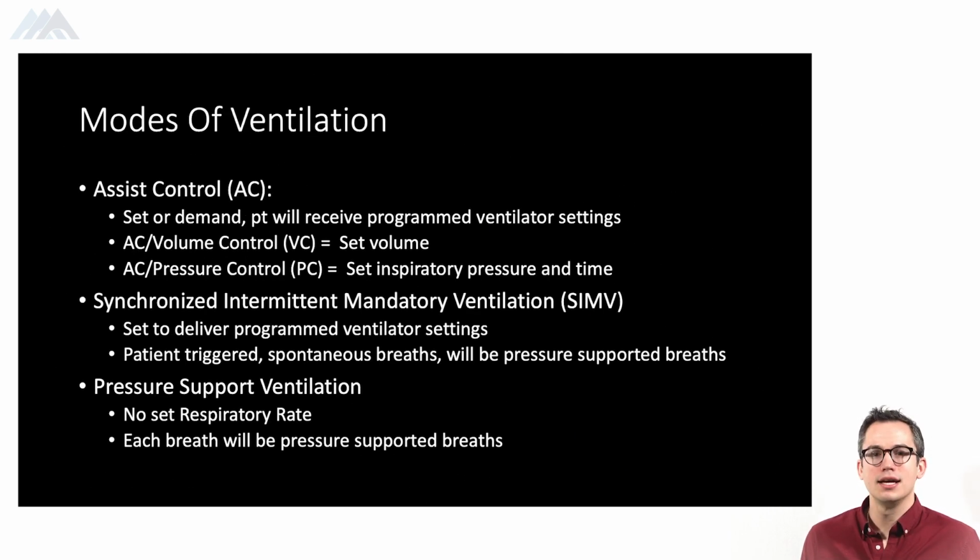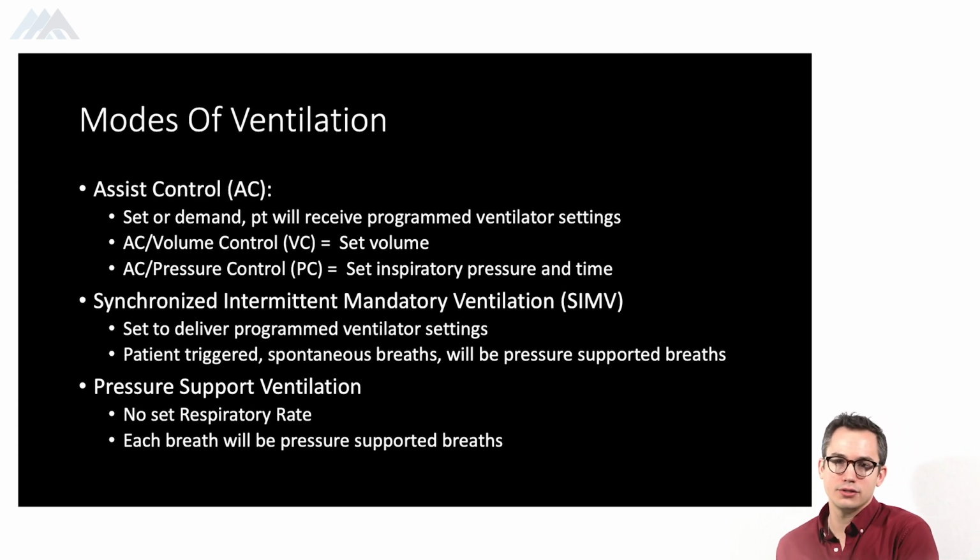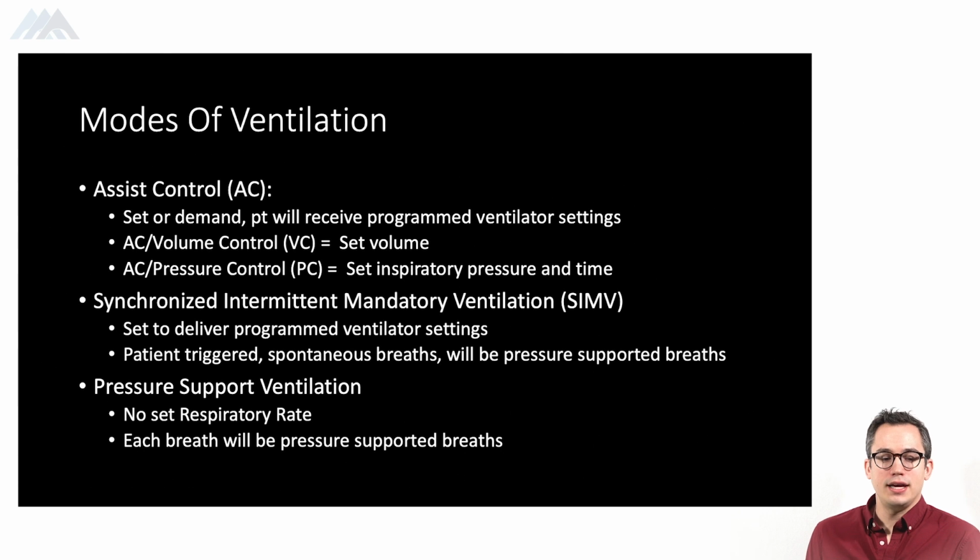Next step here is to choose a mode of ventilation. What are your options? Assist control, volume control; assist control, pressure control; SIMV, or synchronized intermittent mandatory ventilation; or pressure support ventilation. We're not going to talk about SIMV and pressure support ventilation within this video because we're talking about just intubating our patients and they're going to need full support. So we're going to choose either assist control, volume control, or assist control, pressure control.